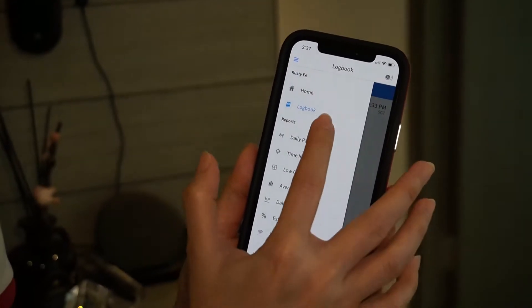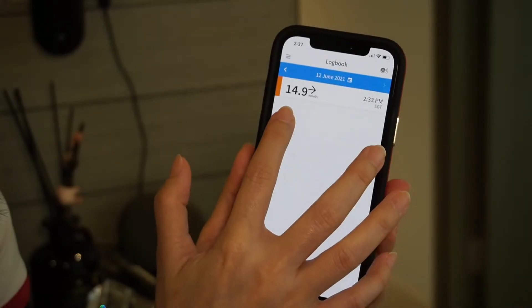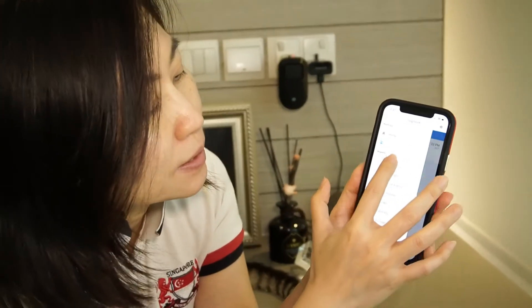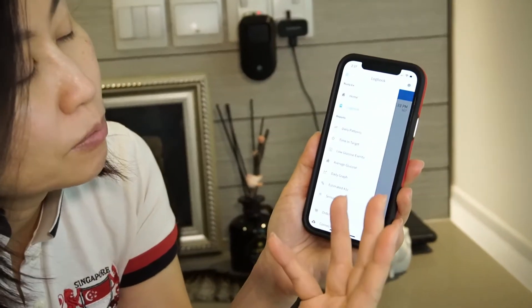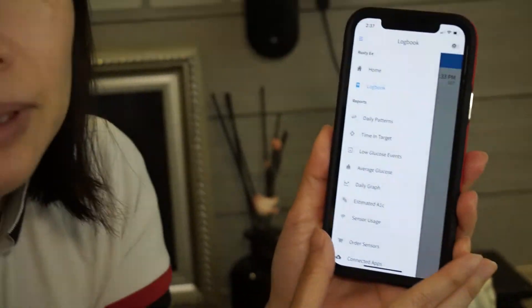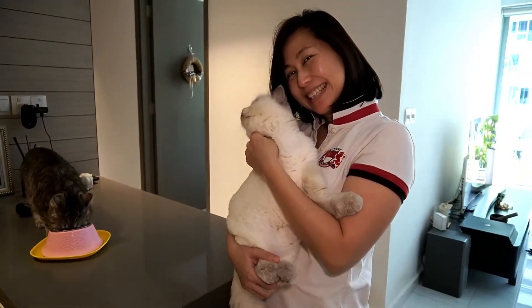What is great about the app is that it has a logbook. When I scan the information, it's recorded there automatically — I don't have to write anything down or key in anything. As you can see over here, you can also take a look at the different reports. Once I have more information, we can check out how the reports look. In the meantime, we will monitor Rusty's blood glucose level more closely.